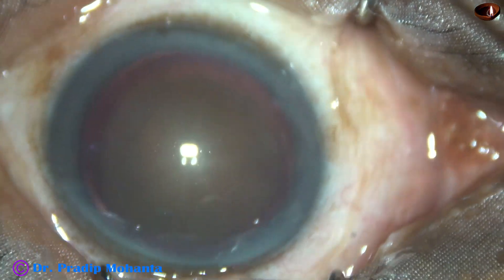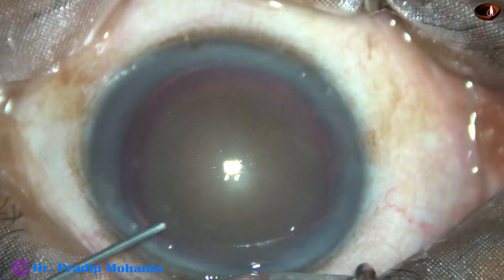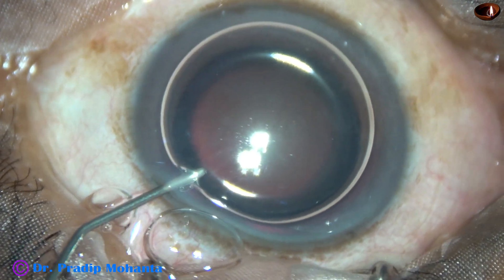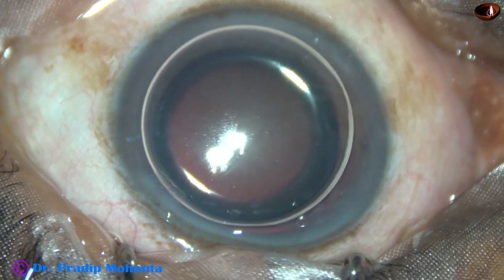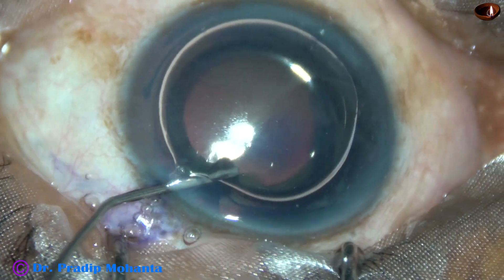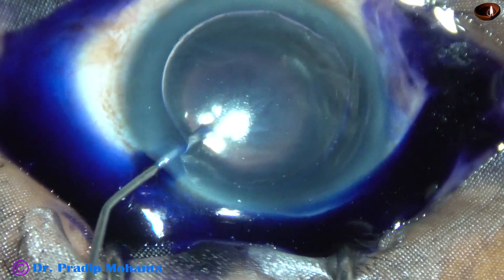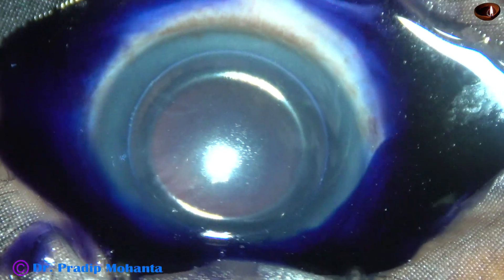An air bubble is injected to fill the anterior chamber. Underneath this air bubble, trypan blue dye is applied over the anterior capsule with a 27-gauge cannula. The dye is applied in such a way that it touches all parts of the anterior capsule.